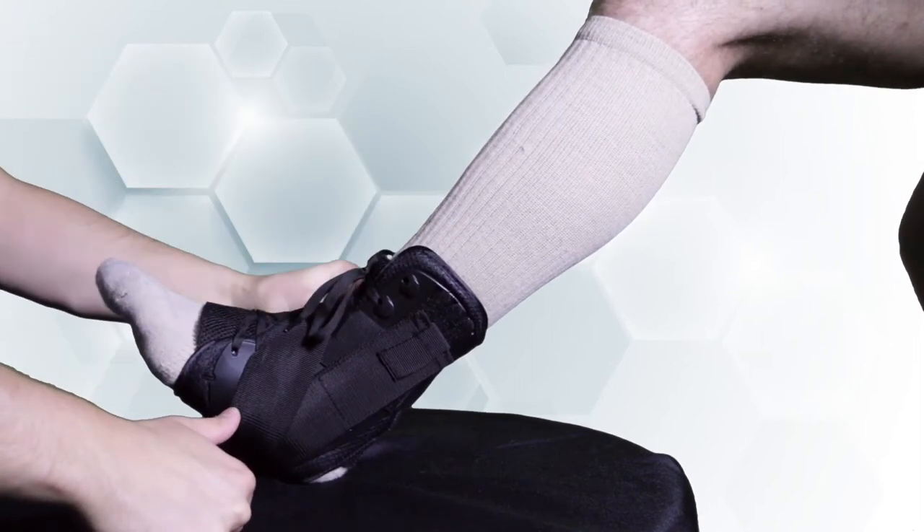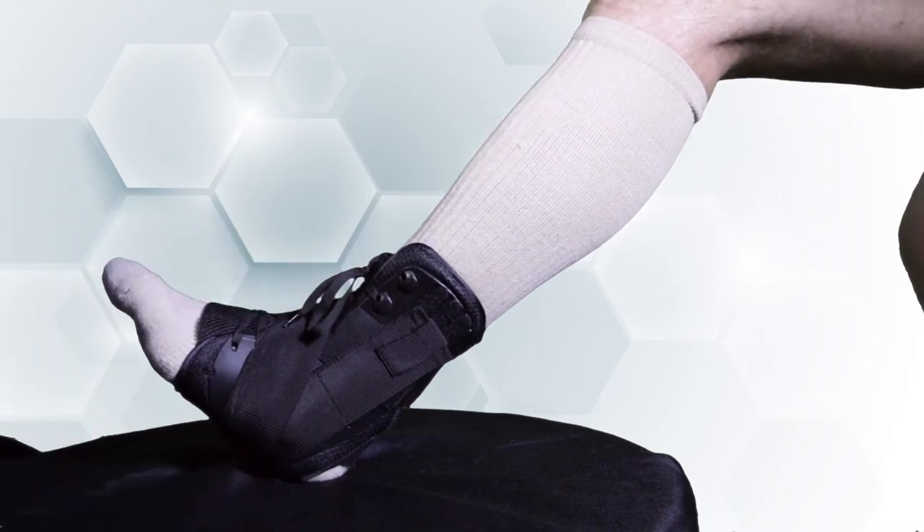When working with the crisscross straps, be sure to keep the lacing out of the way so it does not catch on the closure tab. Once you have fastened the crisscross straps, show the patient how to grasp hold of the loops on either side of the straps and release them, pulling straight up for additional uplift and support. Then fasten them once again.